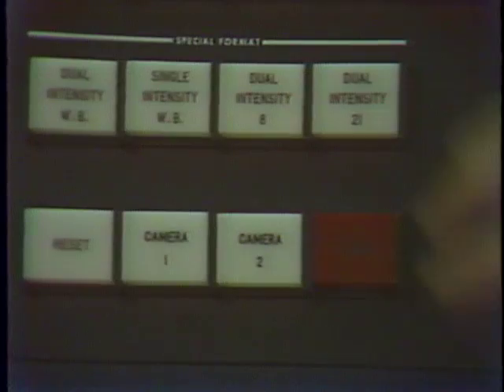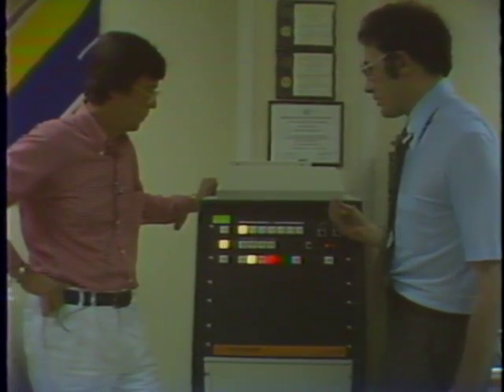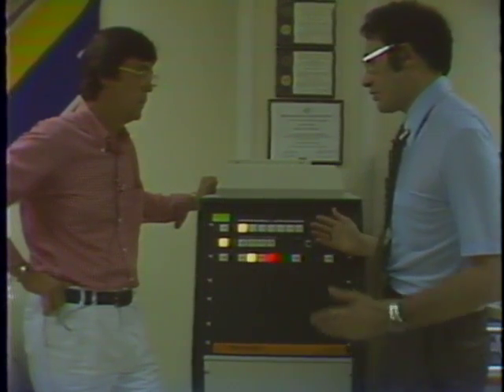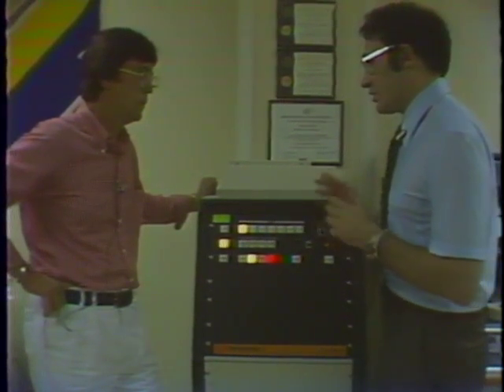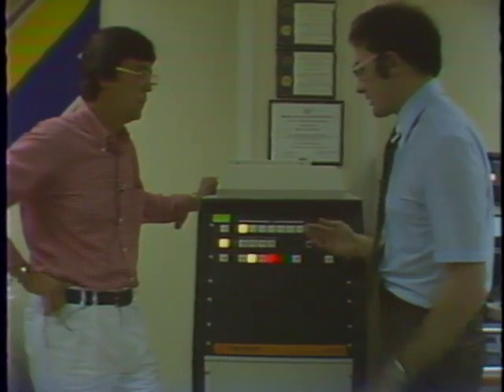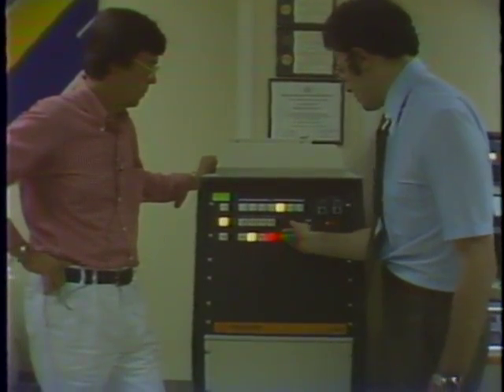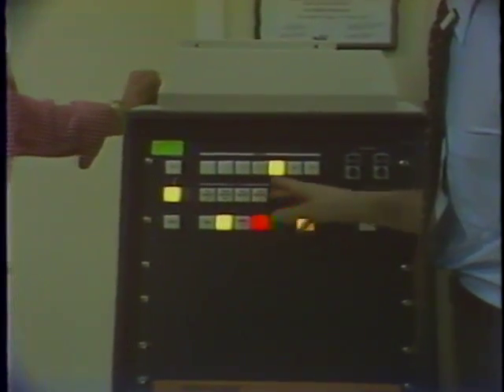This is a photographic formatting machine, and what it does is to take the data that's transmitted from the gamma camera head and record it on a piece of X-ray film in whatever format you want it. So let's say we want to take a series of images that reflect the blood flow to the head, and we want to see where the blood is every 1.5 seconds. So we want, say, 16 images taken 1.5 seconds apart. So I set the timer here to 1.5 seconds, and we'll get a series of images, each exposed 1.5 seconds.